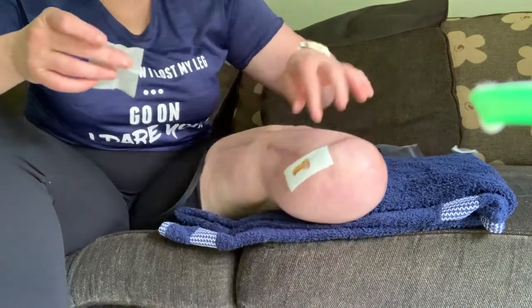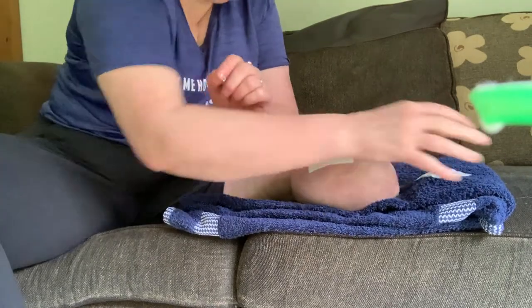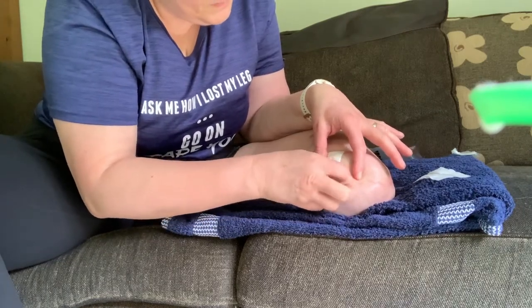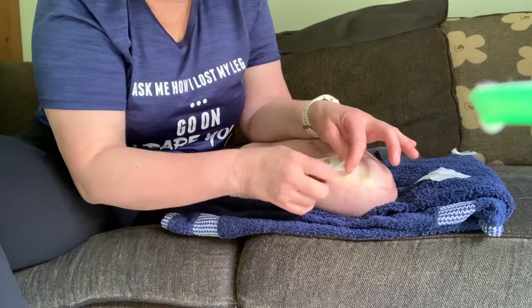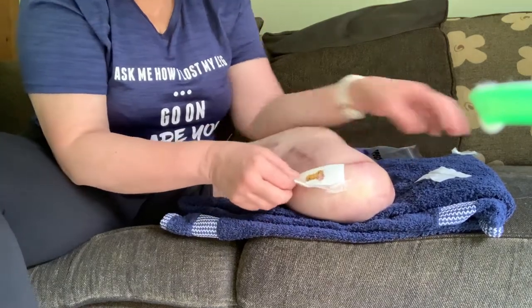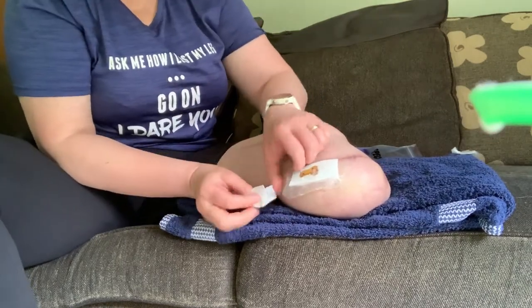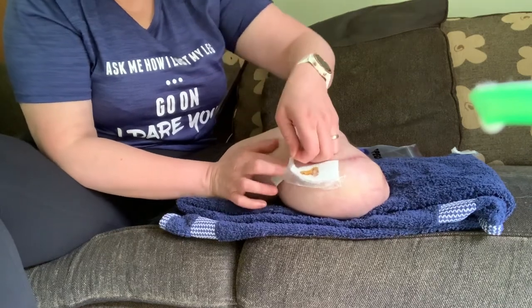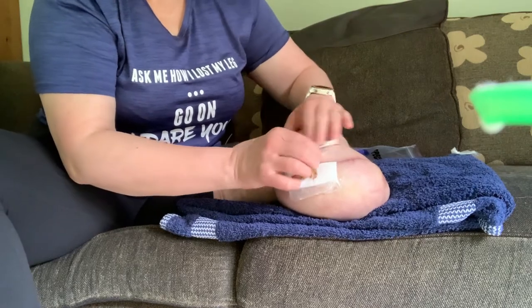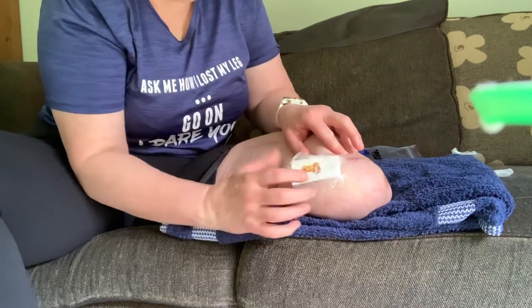So that's the stitch site. Then we take the other one off. Quite sensitive here on the inside of my leg — most of the rest of it I can't actually feel, but this little bit does smart a bit. There we go, got that one off.